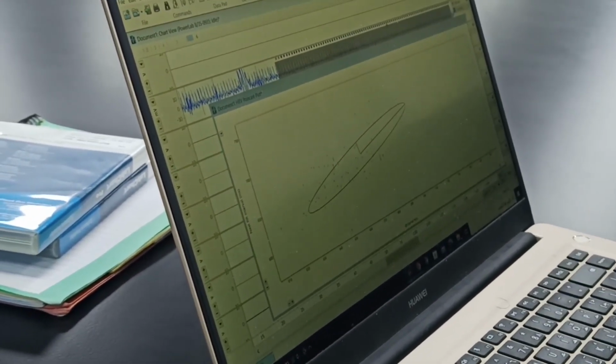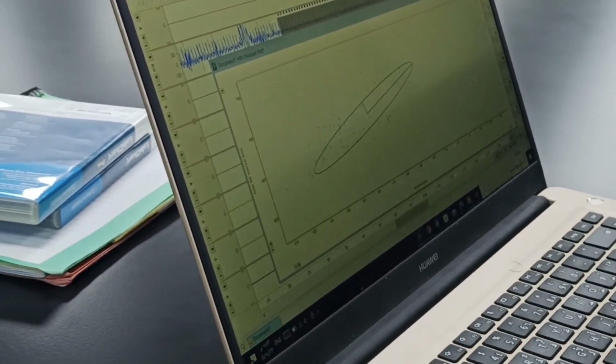Options for making certain plots. One of the plots which is now given in the literature is called the Poincare plot. I'm just going to show this because this is used for SD1, SD2 calculations. So what is this plot? You have got an RR interval, say 700 millisecond. The next interval is 720 milliseconds. So in this plot, this RR interval of 700 will be plotted against the next interval of 720.